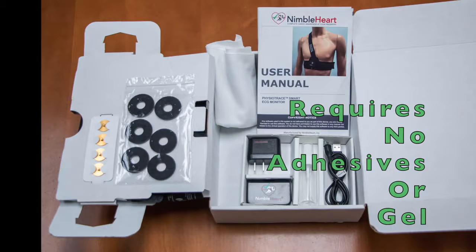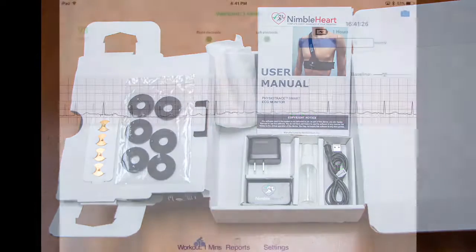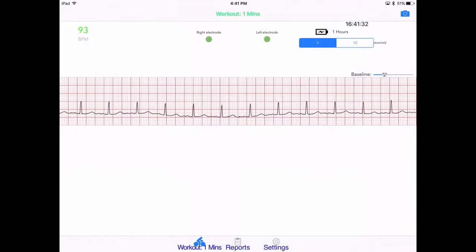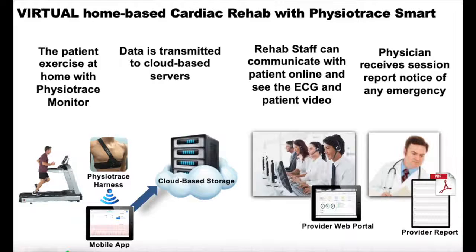The harness material is water-resistant and easy to clean by spraying water and wiping with alcohol. The mobile app collects the ECG data and uploads it to a cyber-secure and HIPAA-compliant cloud portal that the physician and cardiac rehab staff can access.